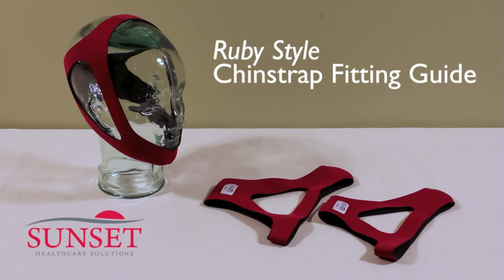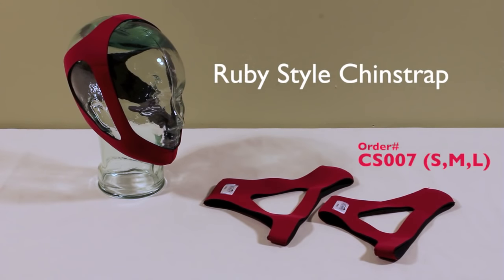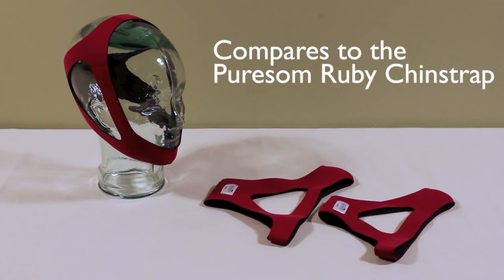Hi, my name is Brenton and I work in the product development department for Sunset Healthcare. Today we are going to demonstrate Sunset's new ruby style chin strap, order number CS007. This chin strap is designed to directly compare with the PureSOM ruby chin strap.